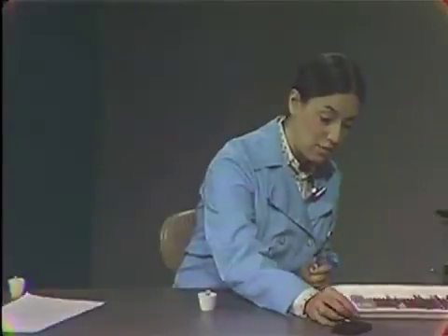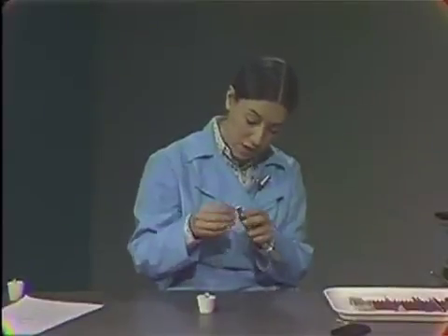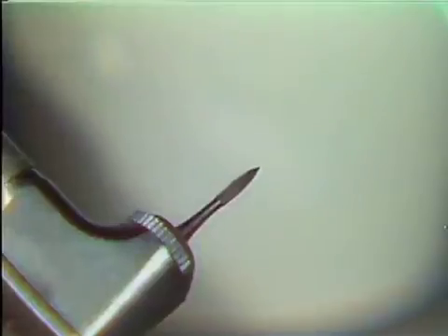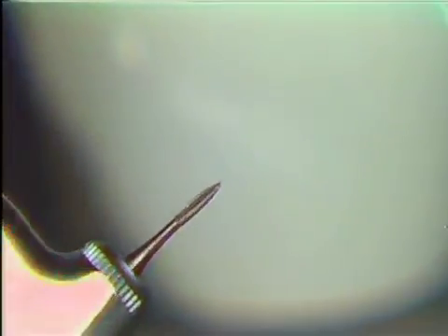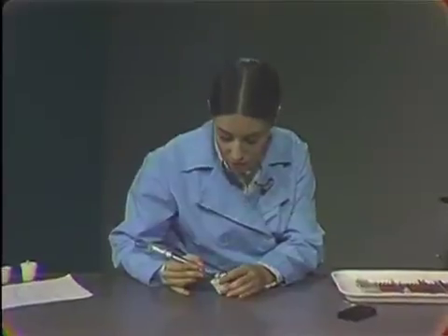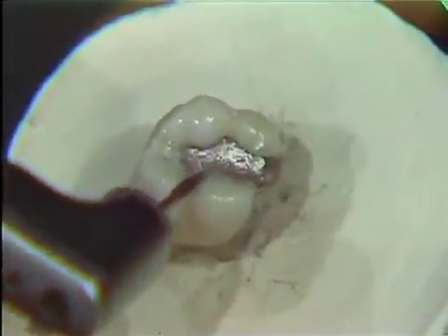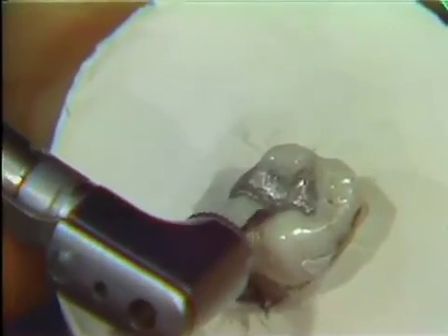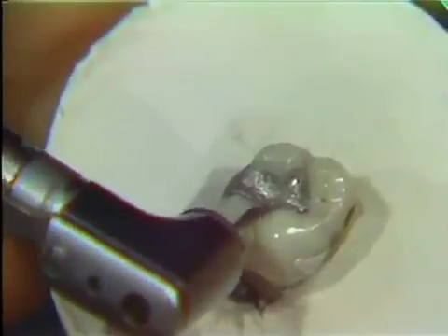After you've removed any gross amalgam, you'll want to go to your 242 or flame-shaped burr. This is the thinnest of your burrs, and it's the easiest to abrade with. You'll see that this burr should not be used interproximally because of the notching it would cause — it's fluted. This burr is used particularly in the buccal groove and lingual groove areas of the occlusal. You can see how it's shaped to just fit in those cupped-out areas, and this may be the only burr you can use in these areas.